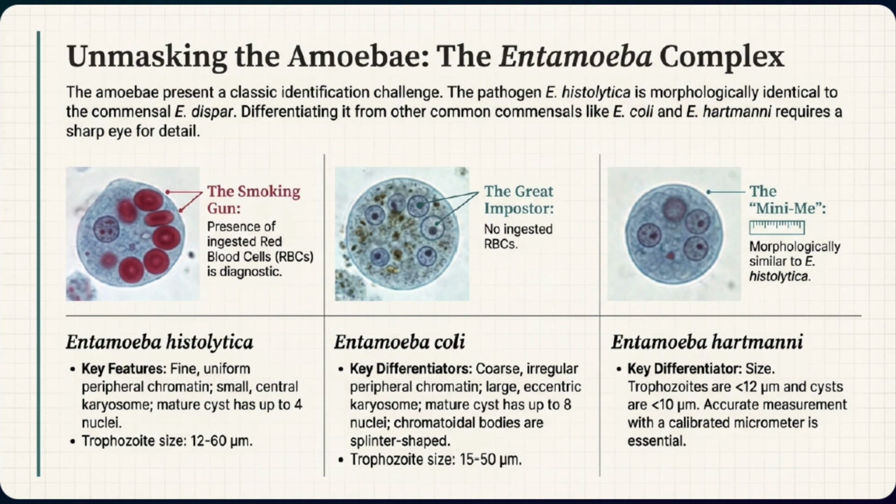So the Entamoeba complex. The amoebas move via pseudopodia, which are just like elongations of their cells, and it's sometimes again tricky to see the movement per se, and it's often not enough for diagnosis because you have relatives that look very, very similar. Also, the size is very important.